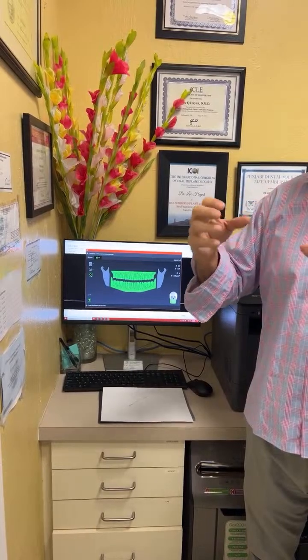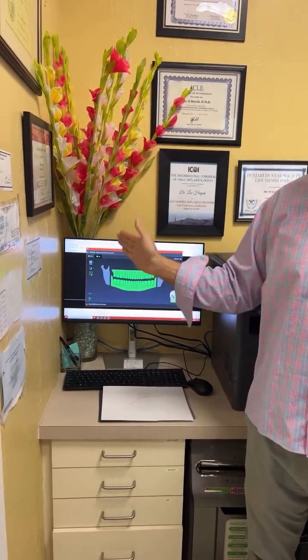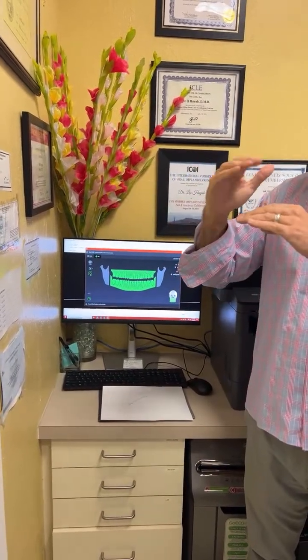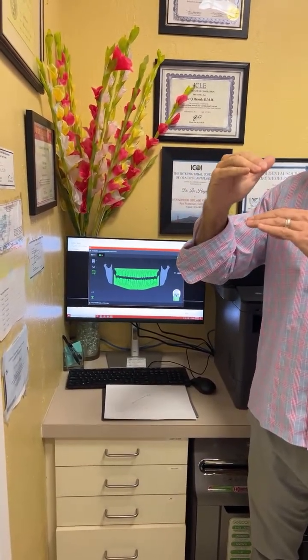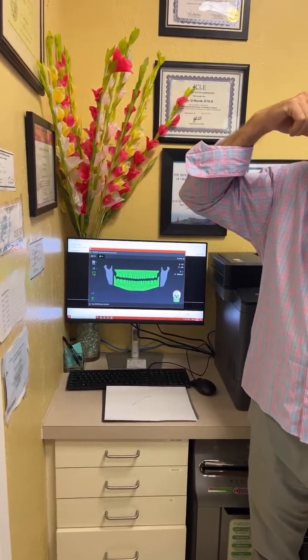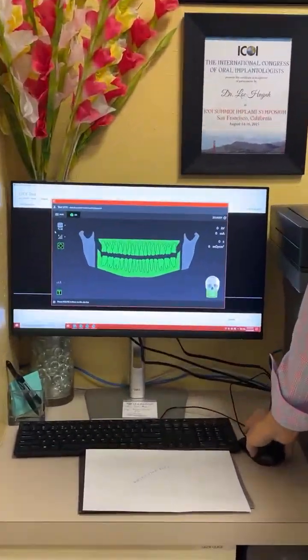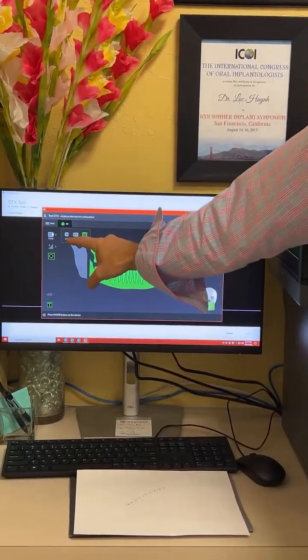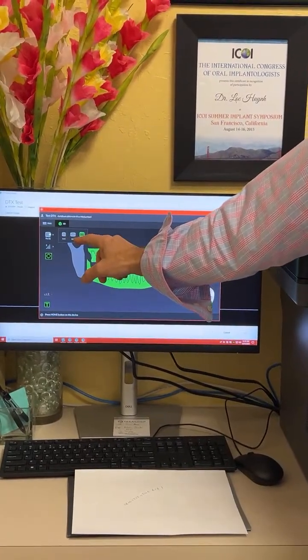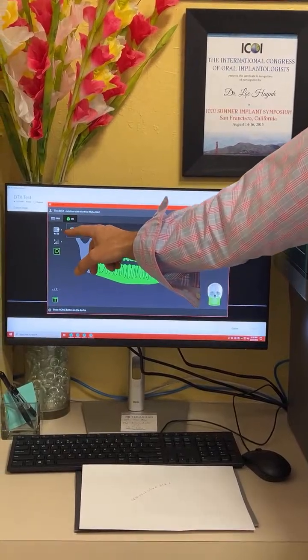So think about a camera with an aperture where you can open up the aperture for more light. Well, on this, we're dealing with radiation. There's an aperture that you can open and you can say, I need more height, I need more radiation, I need to actually image up higher than this. So, remember this? These 3 field of views? Those are presets. But you have the ability to customize this and go anywhere in between these.